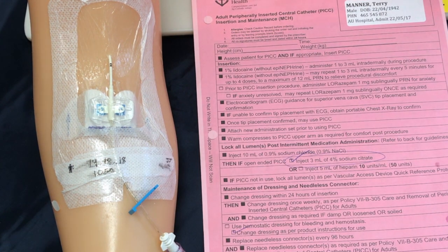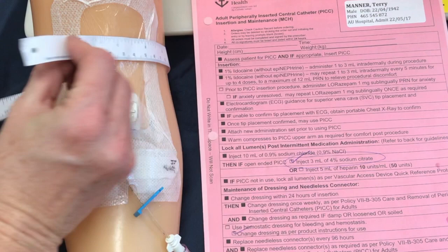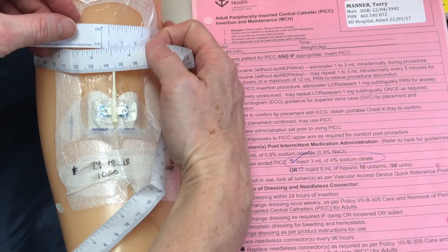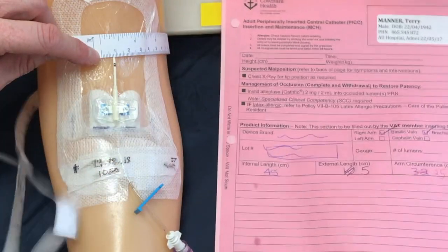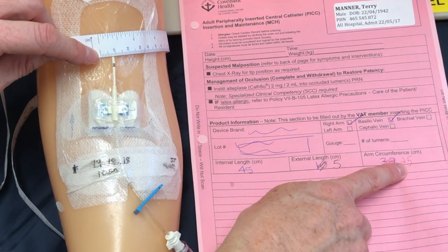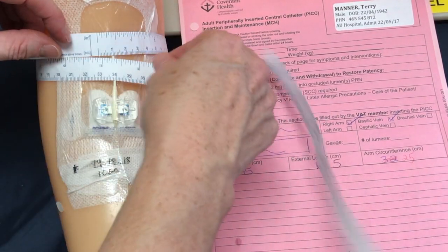One of the tools we need to complete our assessment is a measuring tape. We'll start with the arm circumference — place your tape around the arm so that it crosses over at the insertion site, take the measurement, and note any differences. Here we have 33 centimeters. If we were expecting 25 centimeters from our sample document, that would mean there's significant swelling in this arm since the insertion of the PICC line.